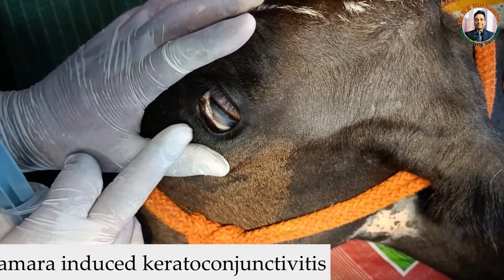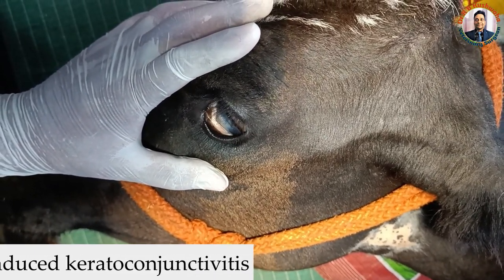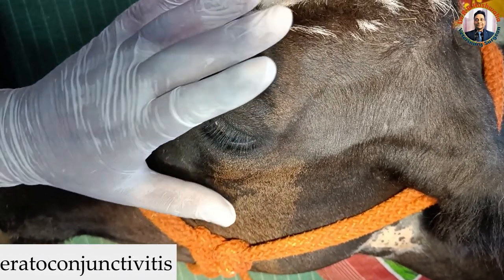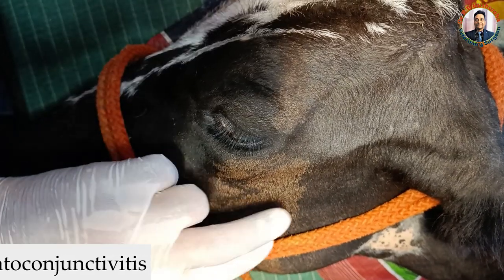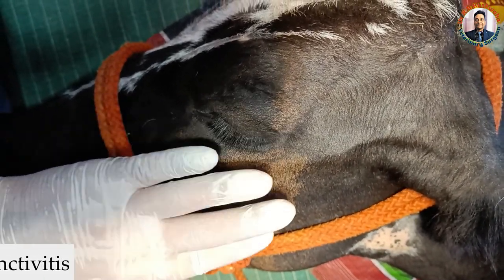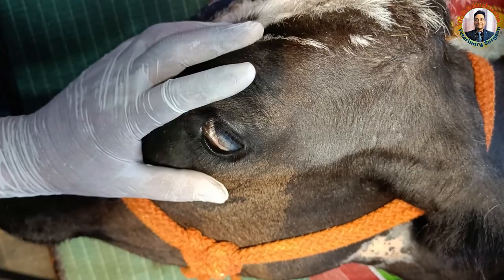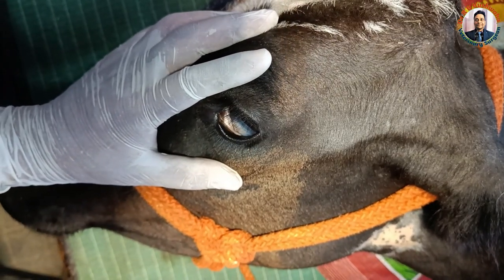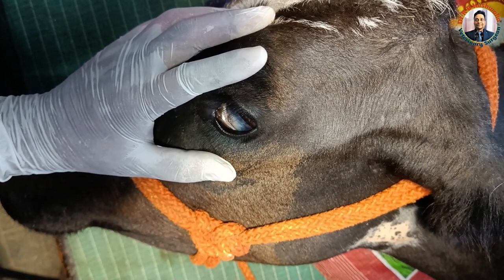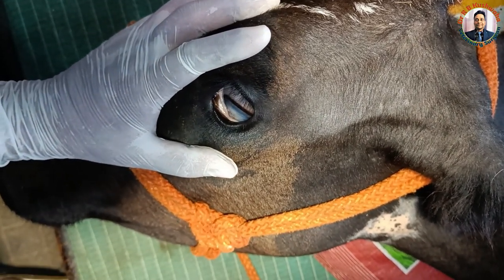For the management of this corneal ulcer, we need to block these two nerves. Besides this, we also sedated this patient using a xylazine-butorphanol-ketamine combination in the ratio of 1:2:3 volume-wise.